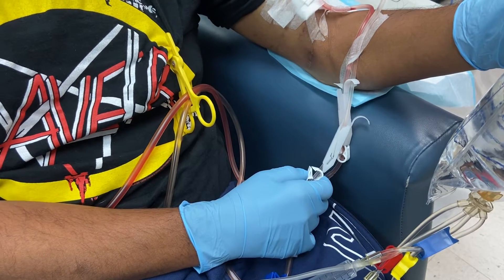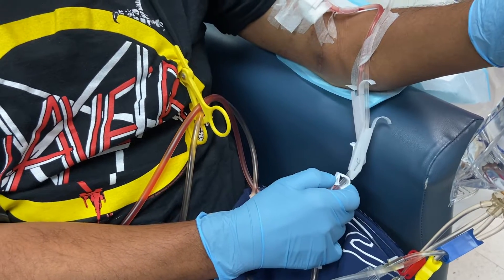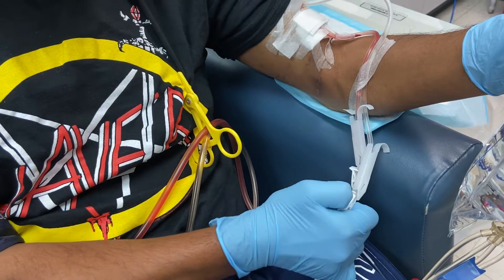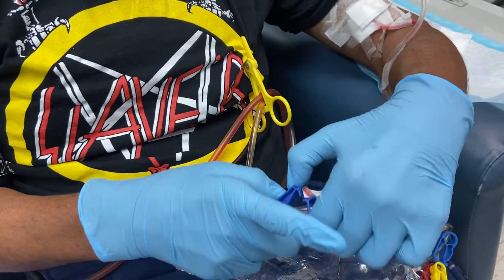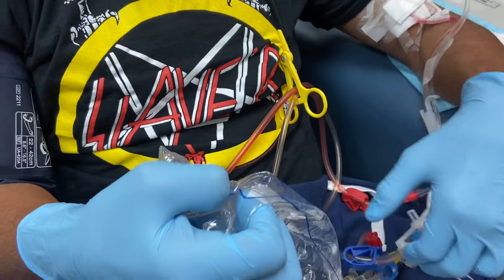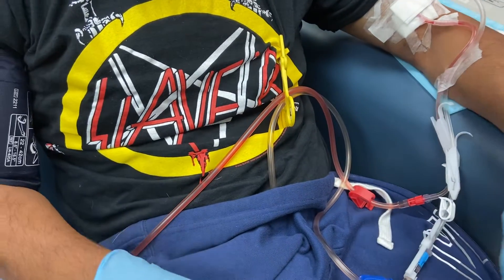Look at your line now, Joseph, and get ready to close as soon as you hear the machine click. Close. Now close the blue — the big blue — and big red.